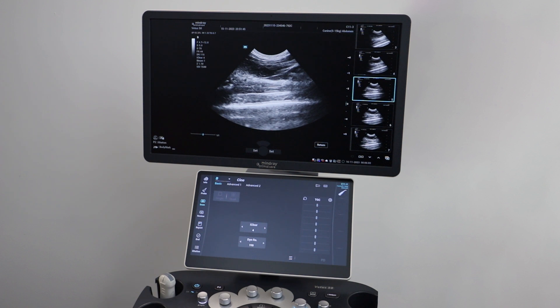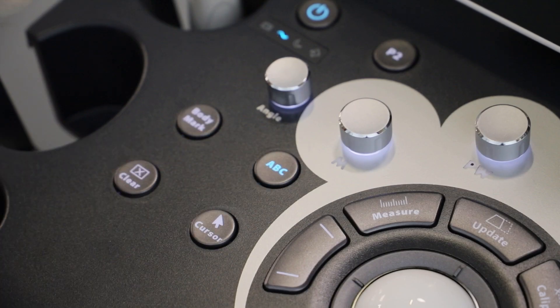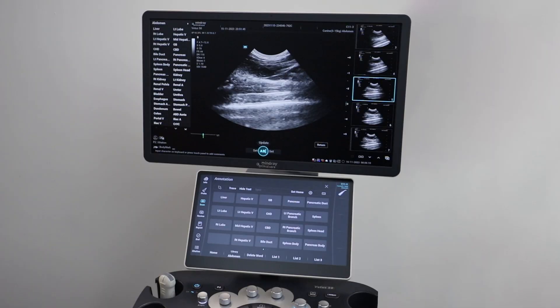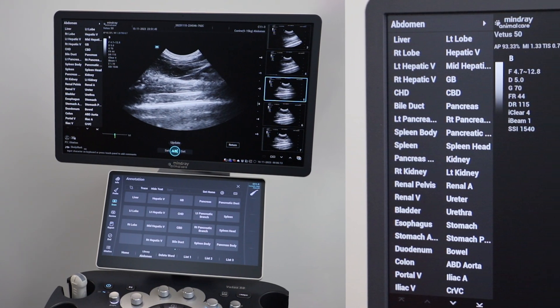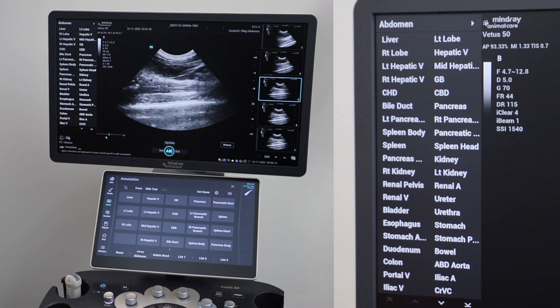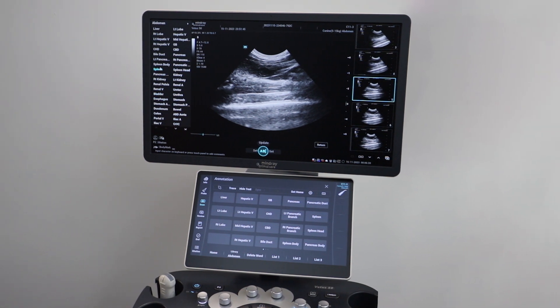To label your image, freeze your desired frame and then click the ABC button to the right of the trackball. A library of terms will show on the right and using your cursor, select the correct label and then it will appear on your screen.